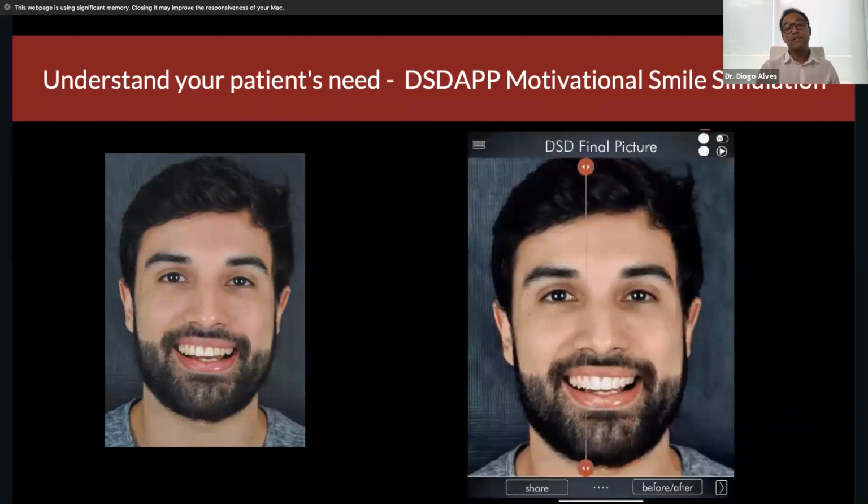The injectable composite veneers using the digital technology. Everything was done in-house, all the design, the 3D design. Then we just sent it to print, created the indexes, and then we had the patient right on the next day, and we could close the deal. So I will show you how the procedure itself worked.